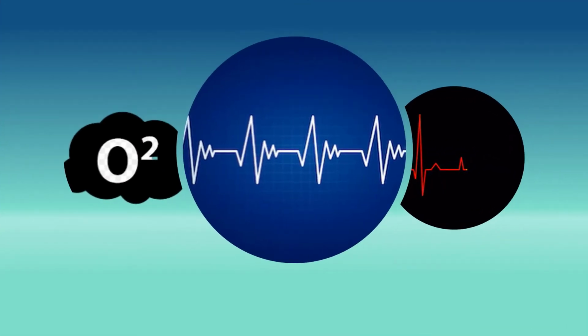After running the project, the Arduino will send a signal to the GSM to find a network. The GSM will take some seconds to find a network and connect to it. At the same time, the Arduino will receive data from the sensor and analyze it. Analyzing the data will let us know what happened to the patient and how we should act according to this situation. The GSM will work in all cases.